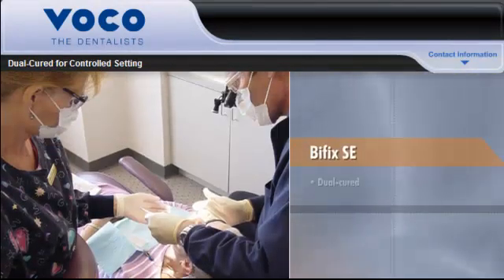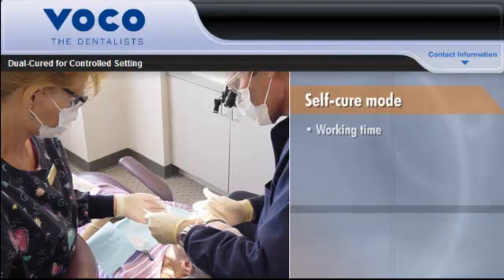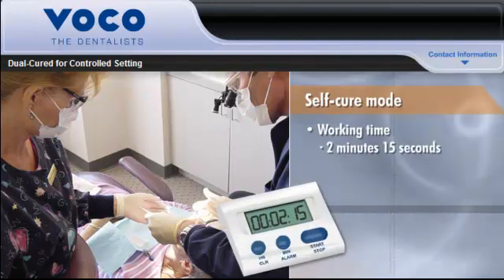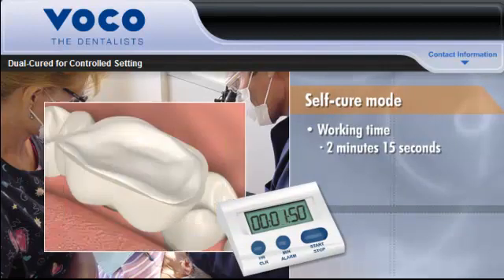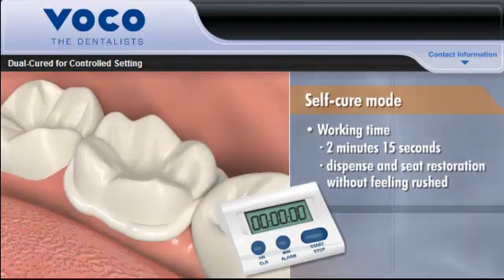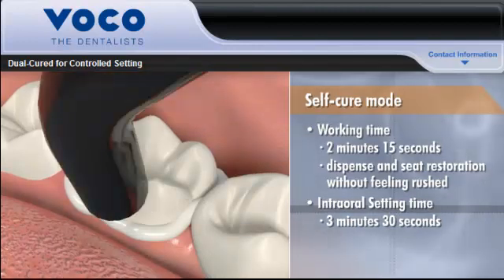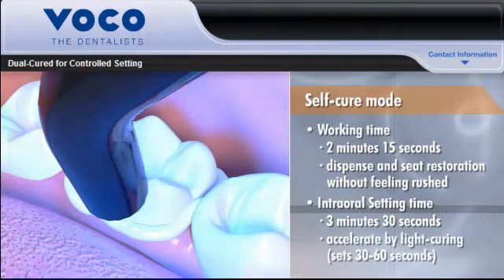Because Bifix SE is dual-cured, it gives you total control over the setting time. In the self-cure mode, Bifix SE provides 2 minutes and 15 seconds of working time, which allows you to dispense the material and seat the restoration without feeling rushed. Once in the oral cavity, setting time is 3 minutes and 30 seconds. When time is of the essence, this process can be accelerated by light curing the material, which reduces intraoral setting time to a quick 30 to 60 seconds.